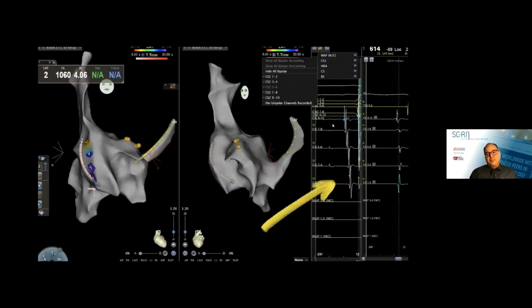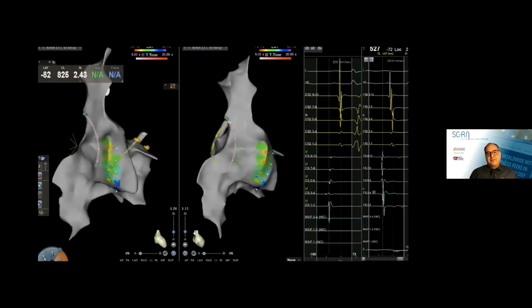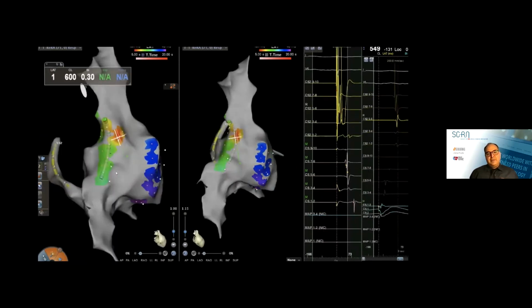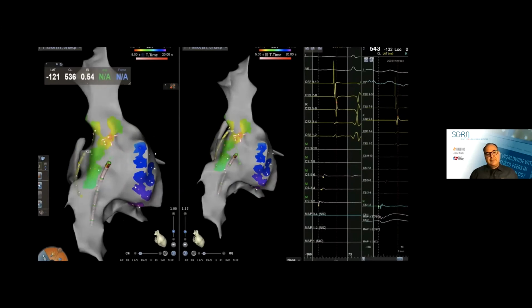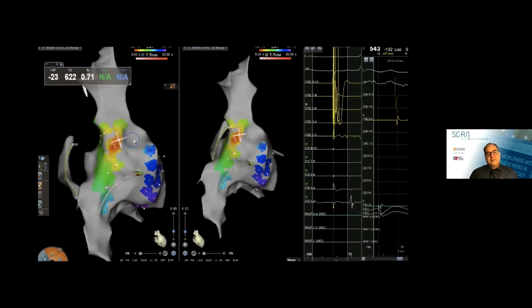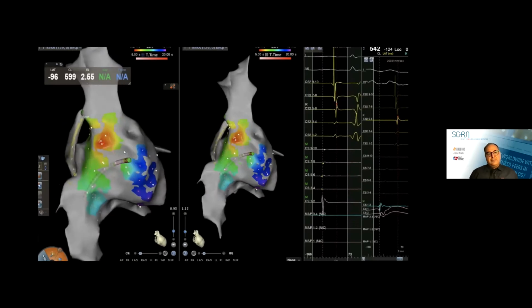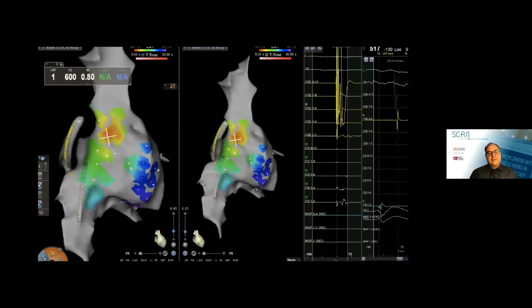So we start a pacing protocol to induce AT and continue mapping when it's inducible. Same cycle length, about 500-600 milliseconds. And very quickly, this image comes out, which gives you very nice local activation in the lateral aspect of the crista. So it's your typical run-of-the-mill crista terminalis. Definitely we're pre-P waves here, activation on the distal. So that seems to be the location of interest. We try to bracket it and terminate it there. So we reinduced again. So a bit anterior to the early activation, posterior, inferior, very nicely localized to that area.